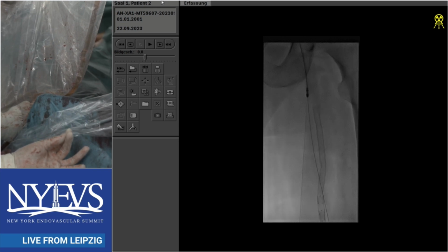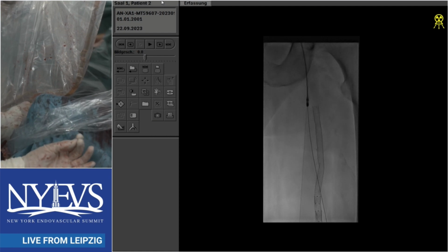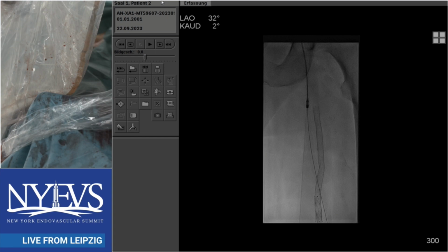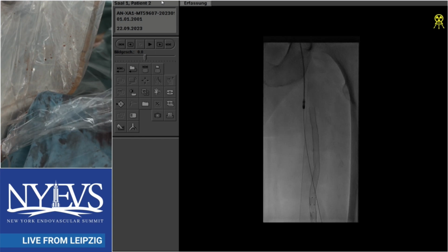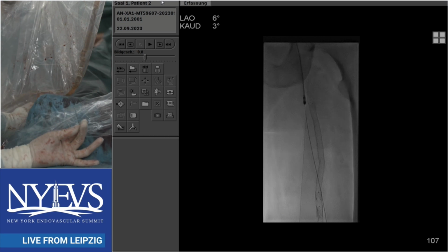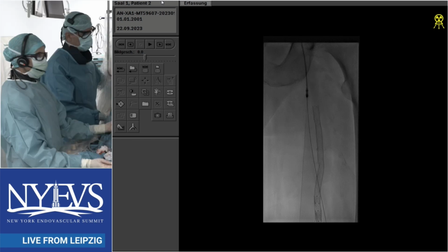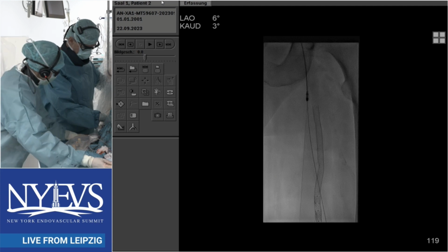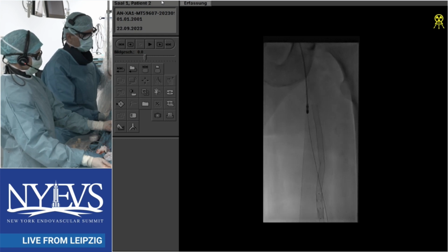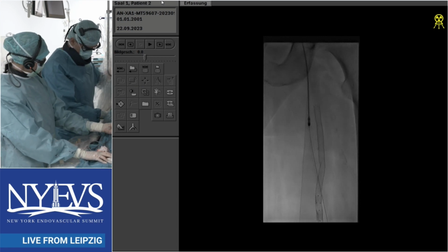Andre, do you ever put a column of contrast in there so you can kind of watch that? Yeah, you could do this. It will probably not really flow into the graft here from antegrade. With 8 French, the device prevents strong injection. As you can see, it's not really helpful. The most important thing is to really observe whether your bag is filling here with blood. If not, you stop again, you continue again. And if this doesn't help, it may be just a stenosis at the proximal anastomosis. You have to first balloon this to allow blood flow to follow the Rotarex into the bypass. And then it works usually. Yeah.